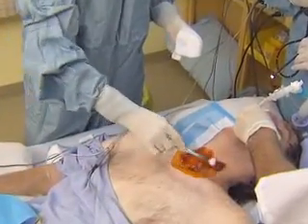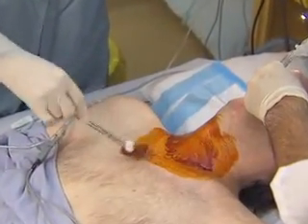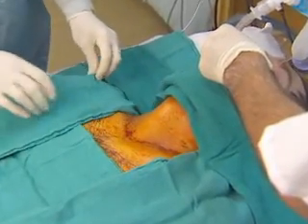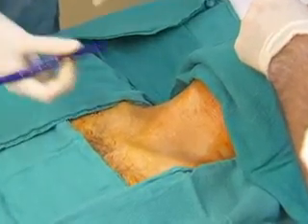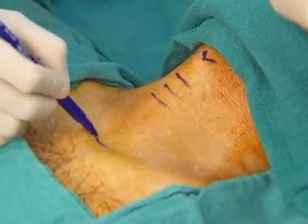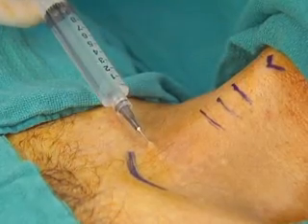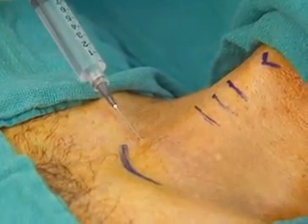First, the patient is positioned as for a traditional tracheostomy with a transverse shoulder roll to permit full extension of the head and neck. The neck and upper chest are sterilely prepped and draped in the standard fashion. Critical anatomical landmarks, the thyroid cartilage, cricoid cartilage, and the sternal notch are identified by palpation and marked. The incision site is infiltrated with 1% lidocaine with epinephrine.